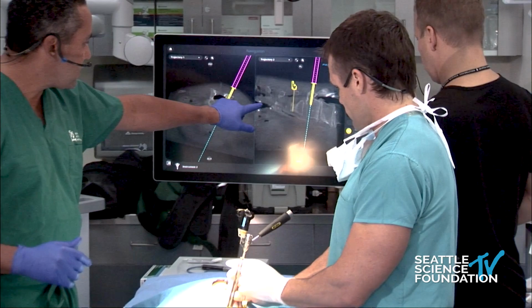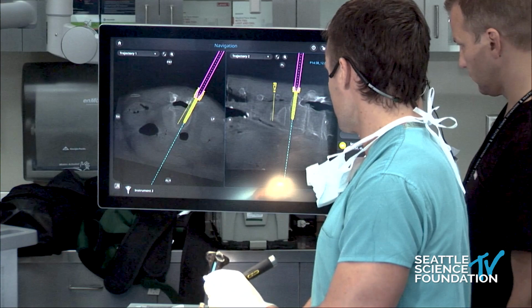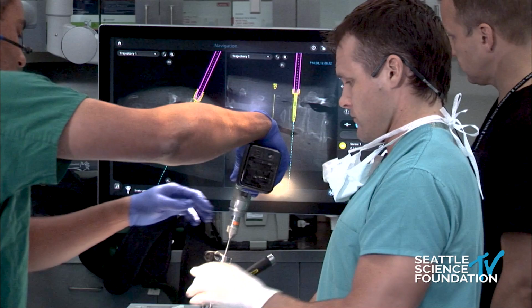So you're going to back out. I'm going to make a little hole just like that. You're going to come back in. You're going to dock down. Like it. Okay. Then we're going to put this thing inside there. And I actually will usually just keep these things together. Gotcha. But it's okay while you're doing this.